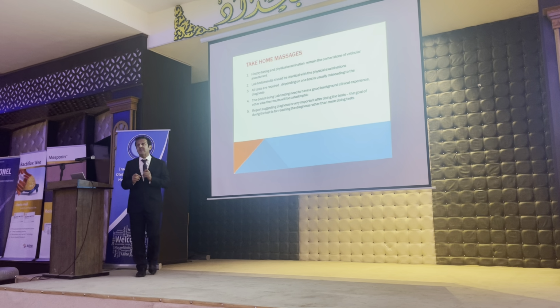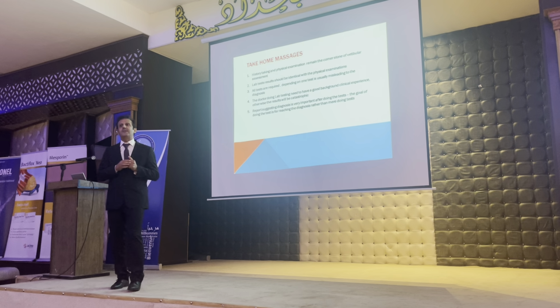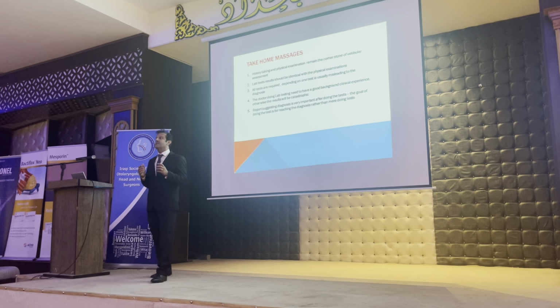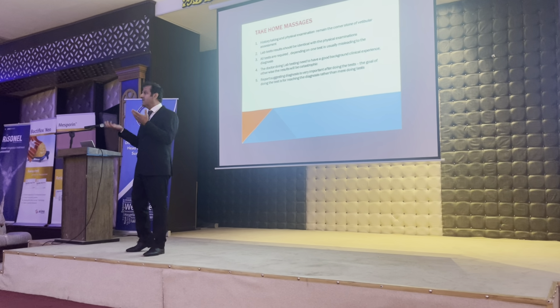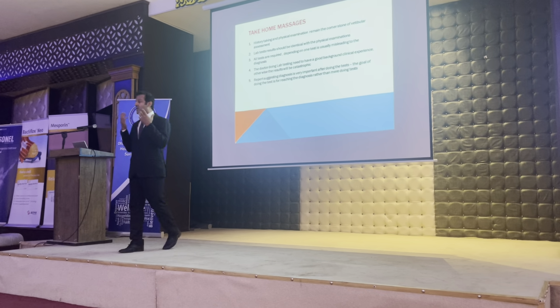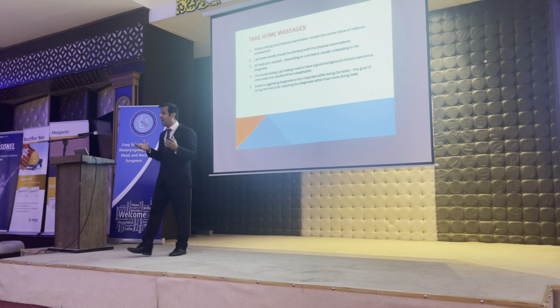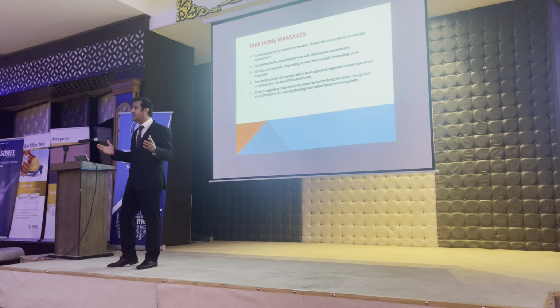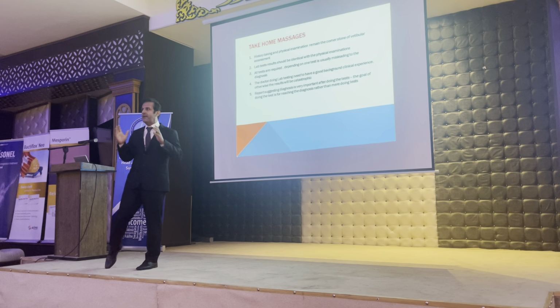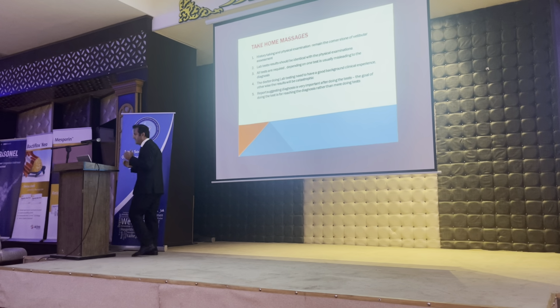I respect the results from Sulaimani. For example, in some critical cases they can suggest even more than one diagnosis. So take home message: if you do your vestibular lab testing for a difficult case and you are not sure of the diagnosis, it is better not to write a report rather than to write a report which will have some pitfalls.